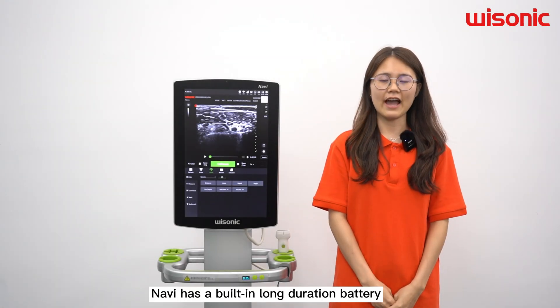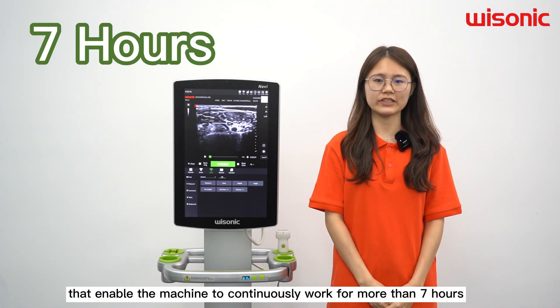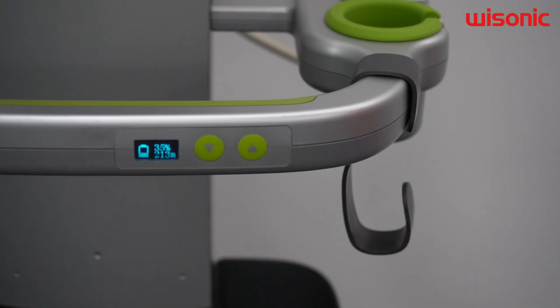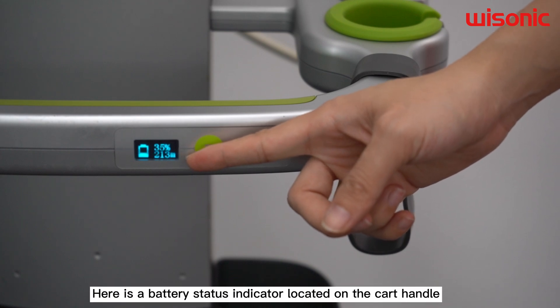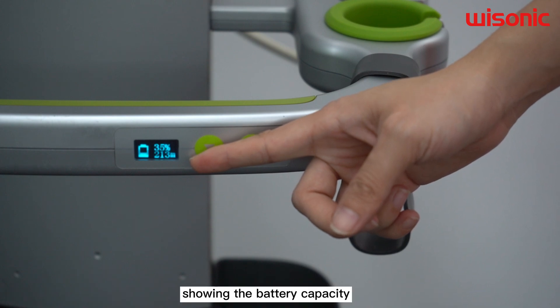Navy has a built-in long-duration battery that enables the machine to continuously operate for more than 7 hours. Here is the battery status indicator located on the cart handle, showing the battery capacity.